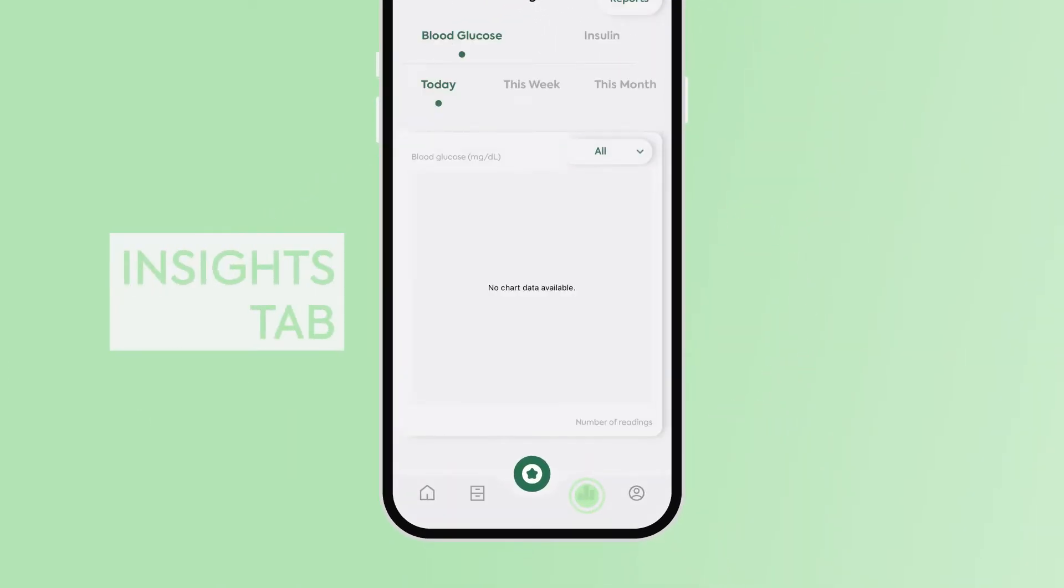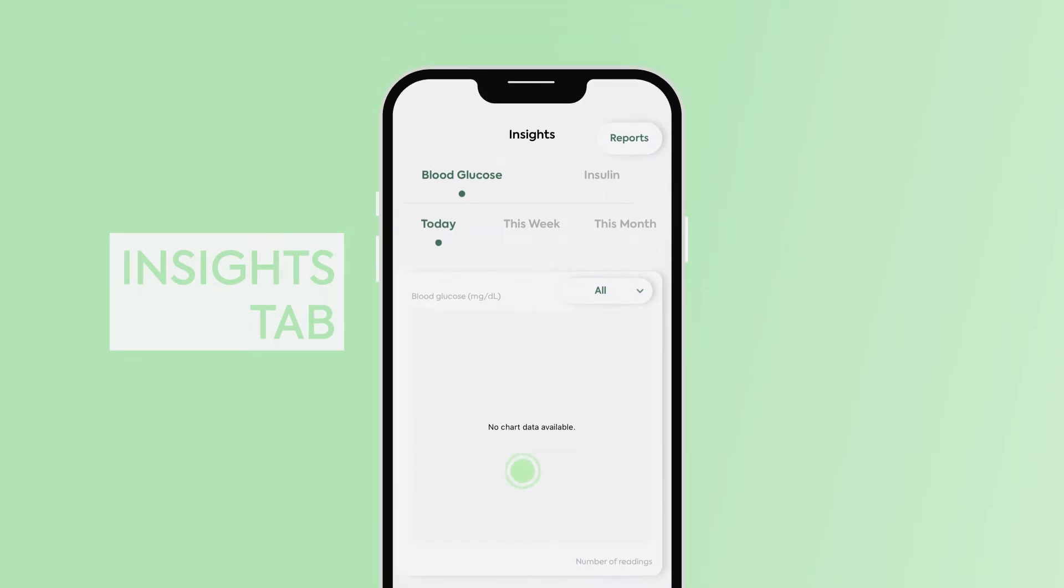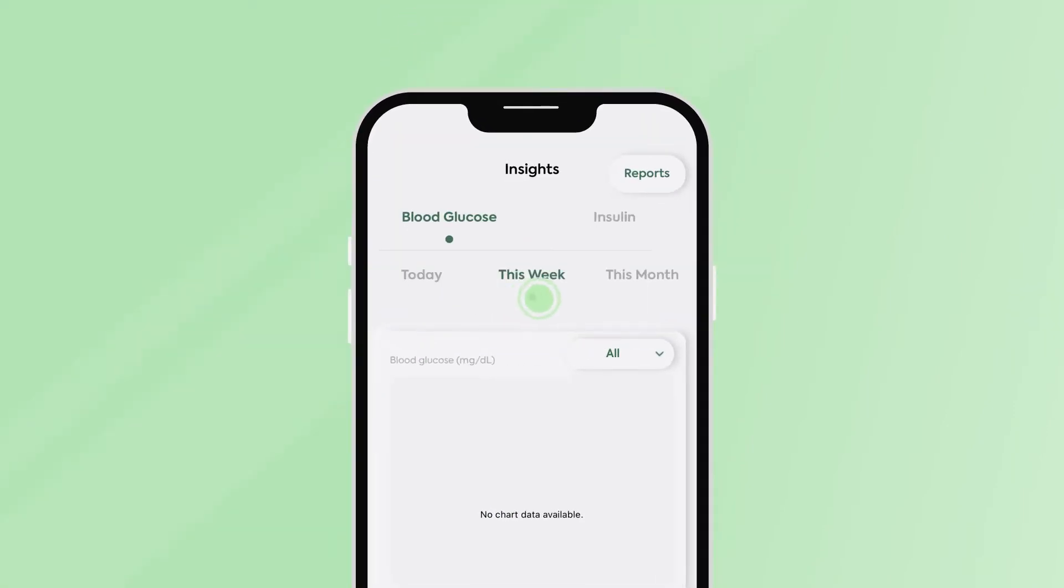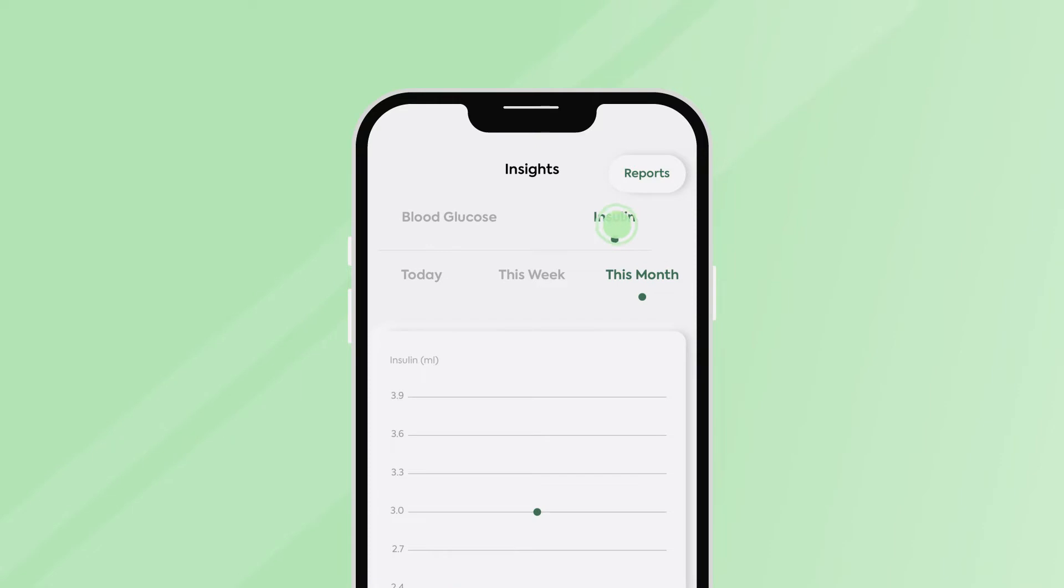The Insights tab gives you a chart reading of your blood sugar levels for that day, week, and month. You can also access the insulin reports here as well.